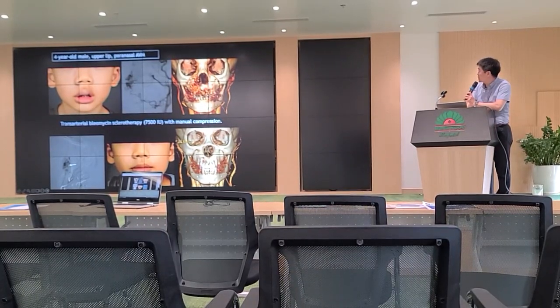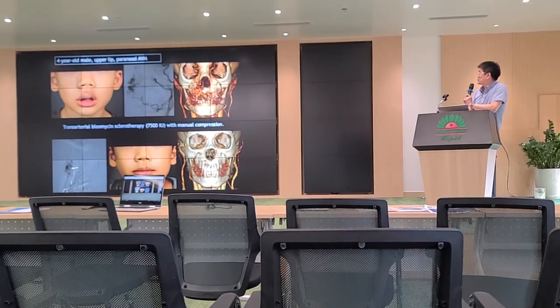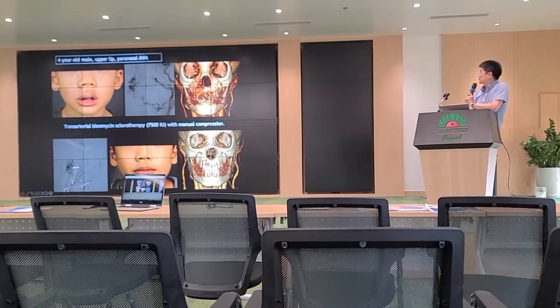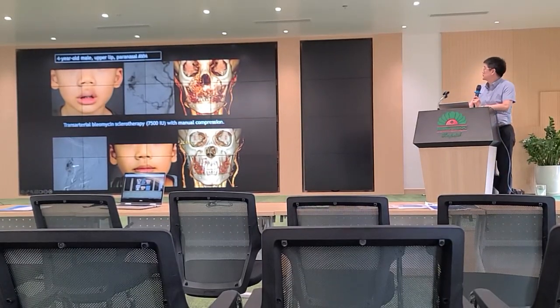Đây là một cái dị dạng động tĩnh mạch môi type 3 và vẫn là bơm bleomycin qua đường động mạch, sau đó thì ép cái tĩnh mạch dẫn lưu về giữ trong vòng mấy chục phút ấy thì nó sẽ phá hủy được cái ổ dị dạng.